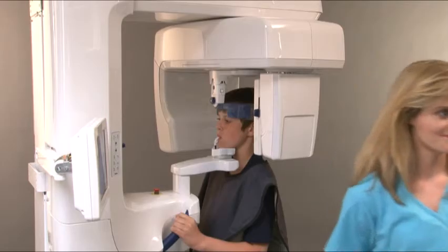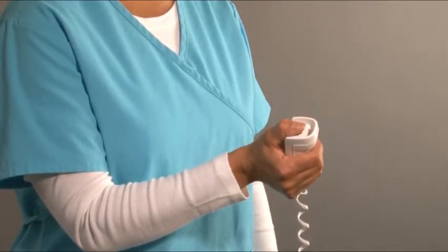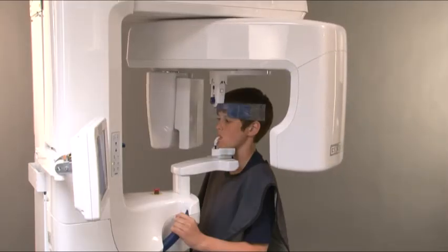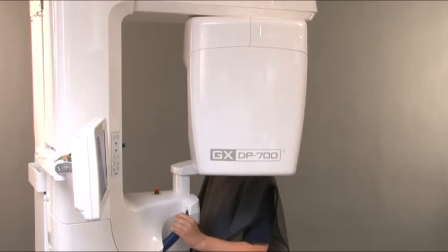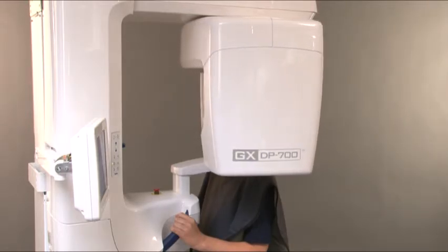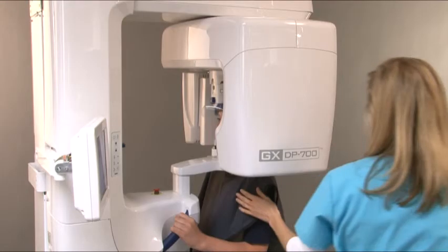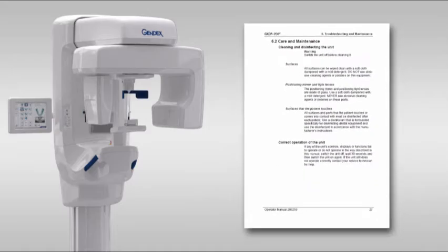Looking at a fixed point in the mirror will help them remain still for the duration of the exposure. Move at least seven feet away from the unit and protect yourself from radiation. Make sure that you can see and hear the patient during the exposure. Press and hold down the exposure button for the duration of the exposure. The rotating unit will move around the patient's head and then stop; when the rotating stops, the exposure has been taken. After the exposure, release the head support and assist the patient in getting out of the unit. Follow the instructions in the manual for decontamination of system parts.